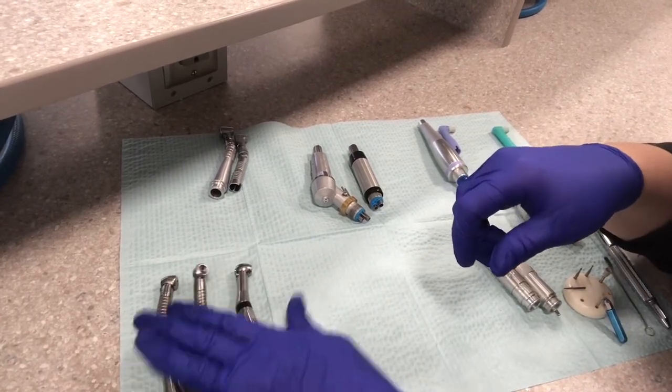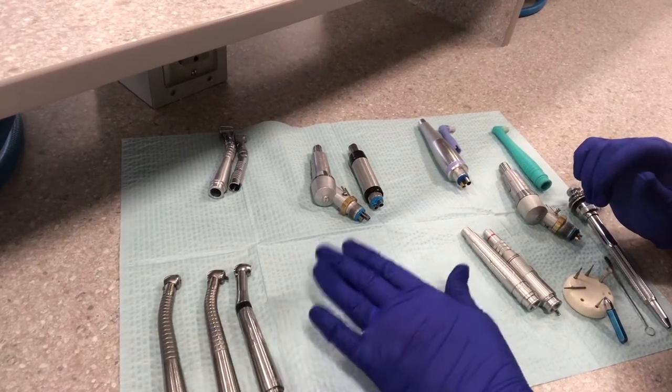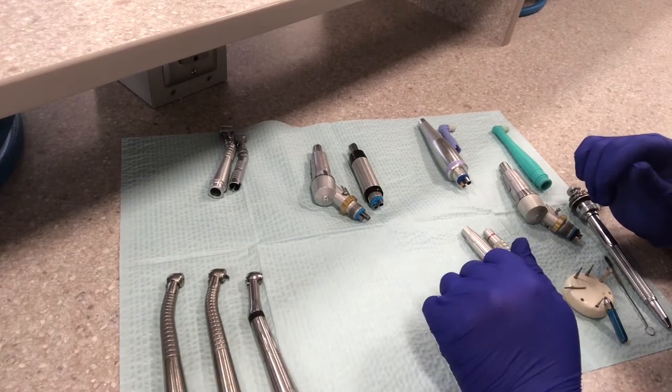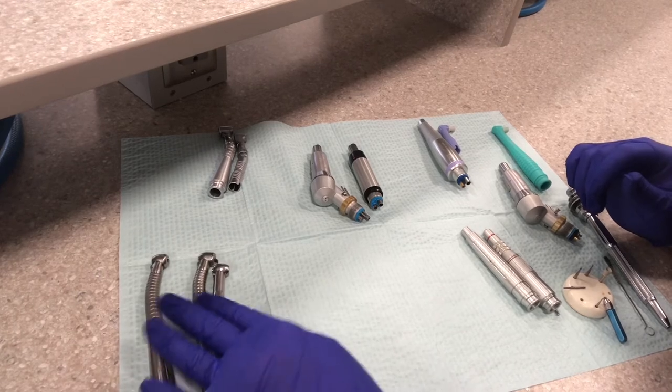So these are your high speed handpieces — the ones that have the fiber optic light and remove bulk tooth structure. You don't have any attachments that go with those; they just hook right onto the hose and they are good to go.